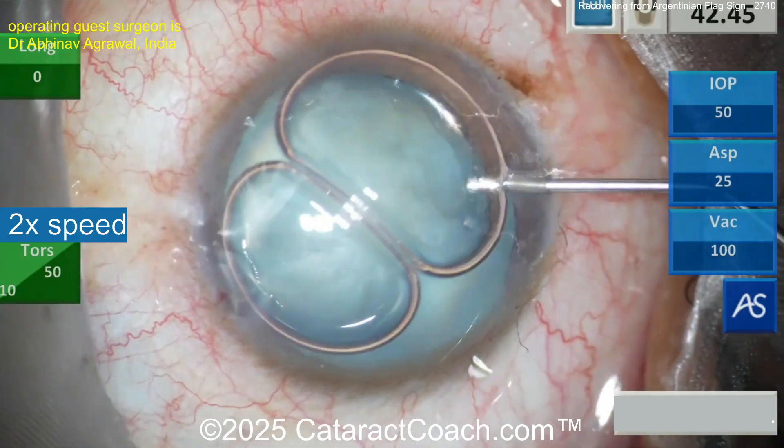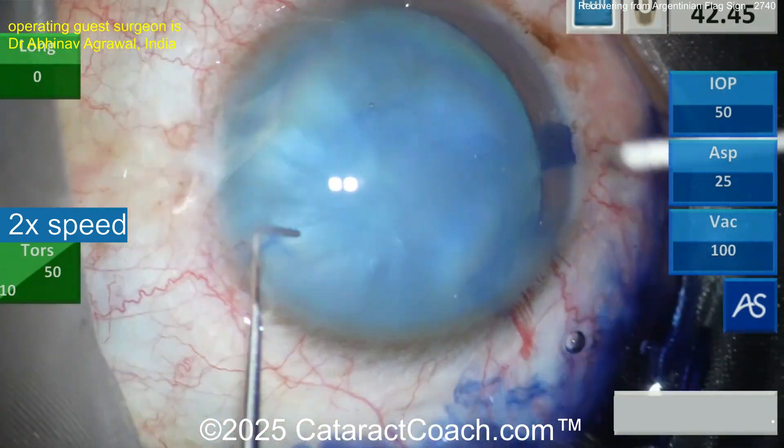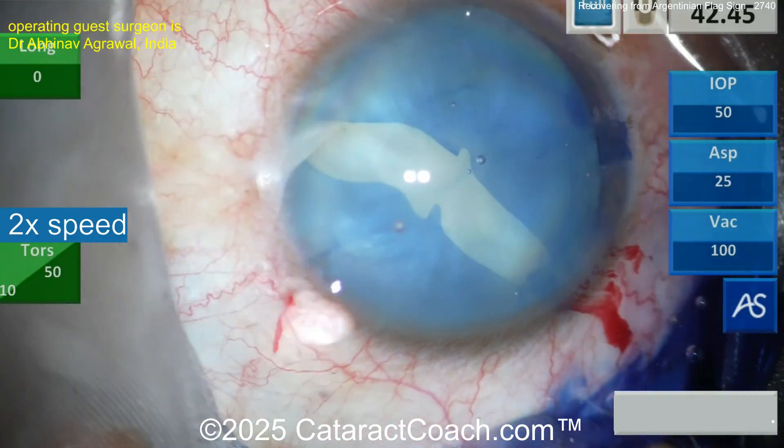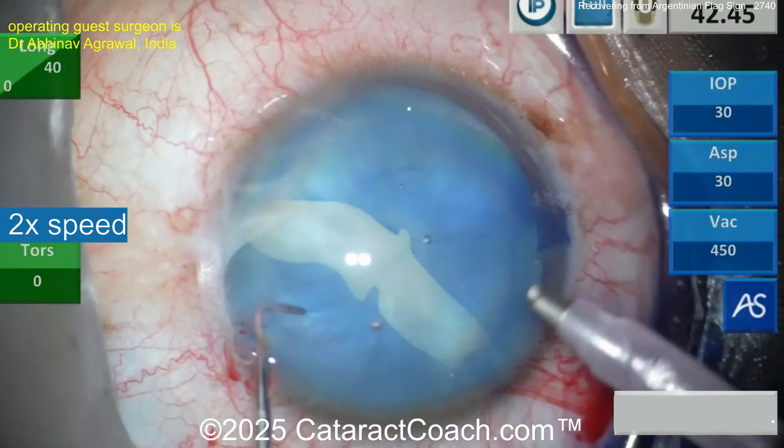He's got a white cataract here — intumescent — making some paras, putting the trypan blue dye. There's the main incision. There's the viscoelastic. And now, starting in, and it rips just like that. Hey, this happened to all of us. It's probably a young patient, very intumescent, very pressurized bag.